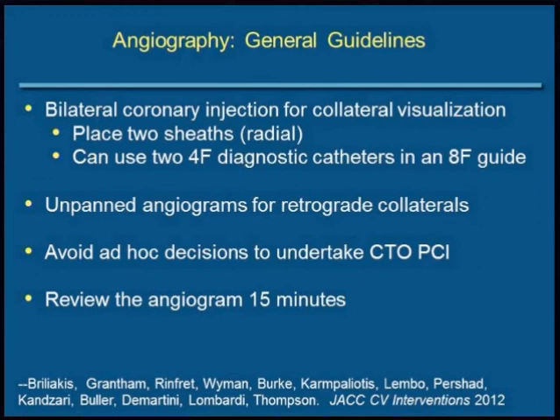Another particular technique that can be used is to upsize to a larger guide and place two diagnostic 4 French catheters to inject both the left and right coronary. It's important to realize that when one looks for collaterals, especially septal collaterals to connect the LAD to the right coronary, an unpanned angiogram is very, very important. We're typically panning, looking for the larger collaterals, but for looking for fine microchannels, an unpanned angiogram is very, very important to really see that fine detail.